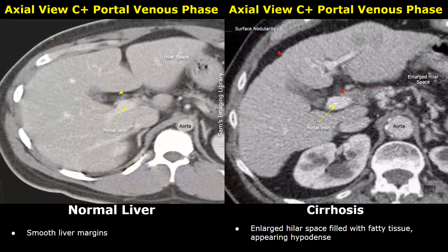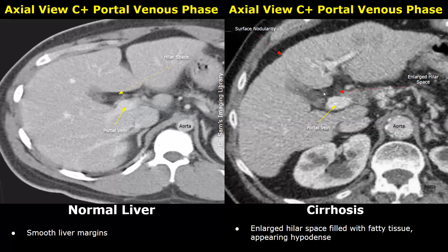In the image on the left we can see the normal portal vein and the hilum. The space around the portal vein is the hilar space — normally there is a small amount of fat tissue appearing hypodense. But in cases of cirrhosis the hilar space is enlarged: the liver shrinks and there is more fatty deposition in the hilar space. You can see an enlargement of this hilar space with more hypodense areas — this widening of the hilar space can also be seen in cirrhosis.